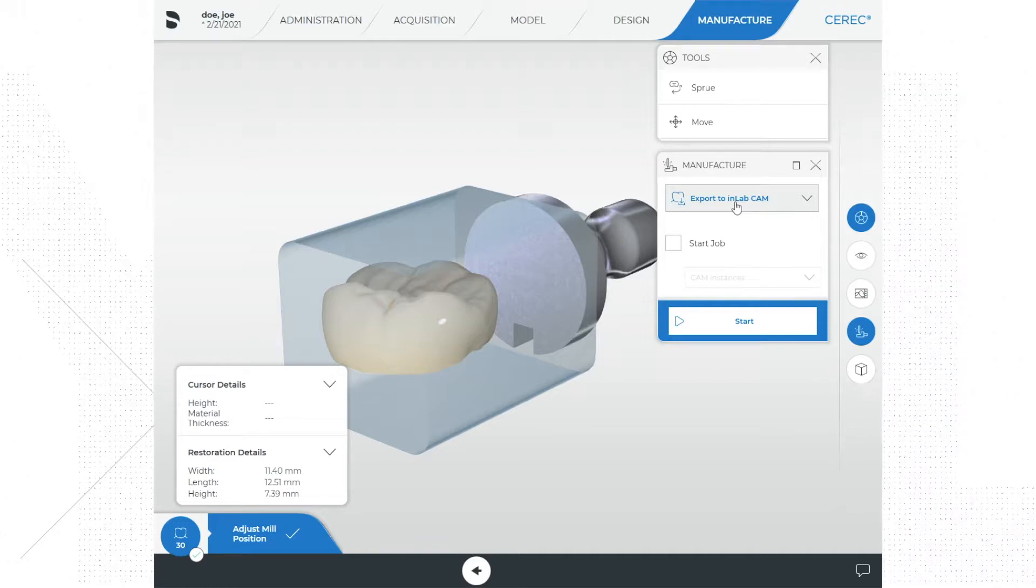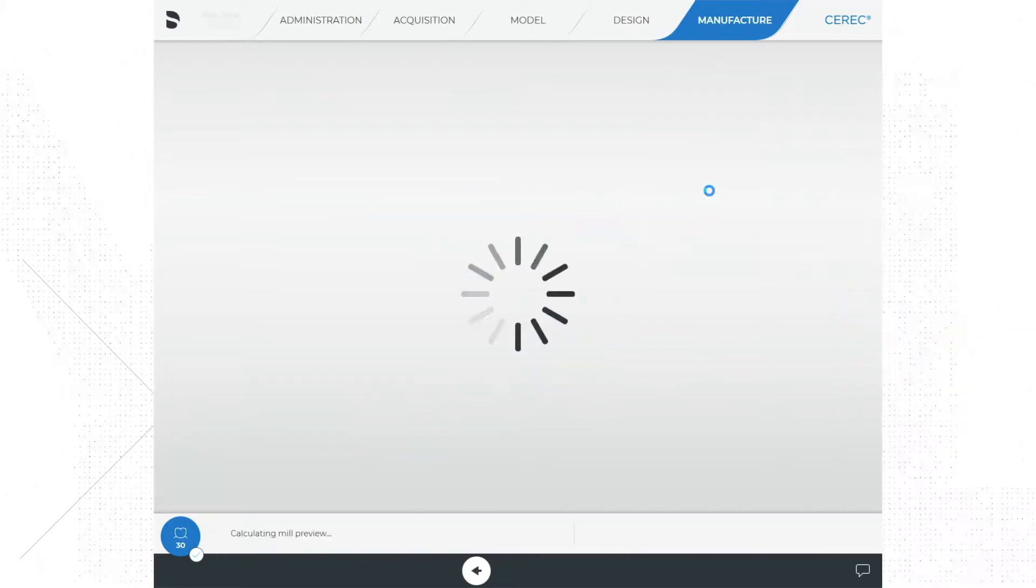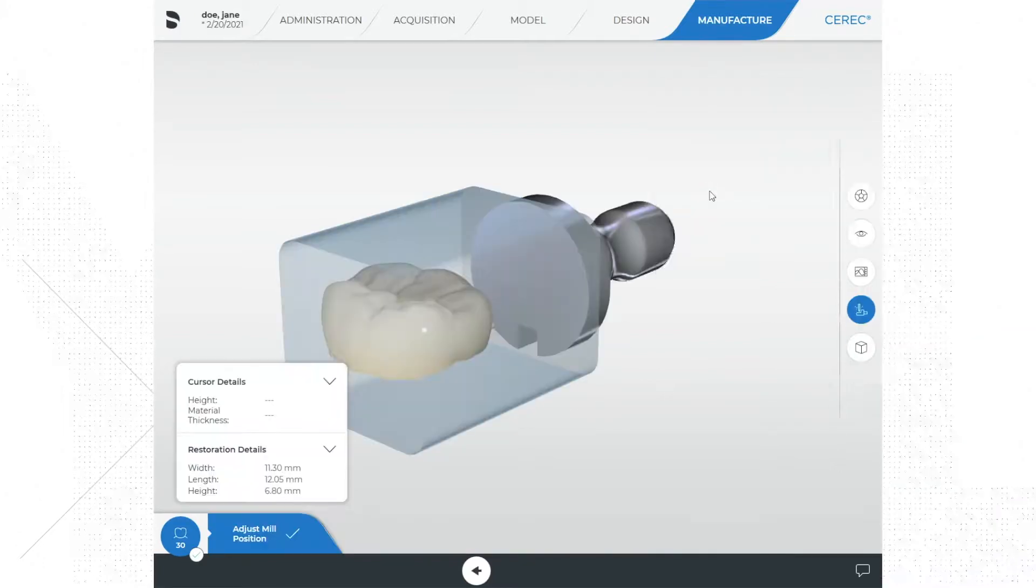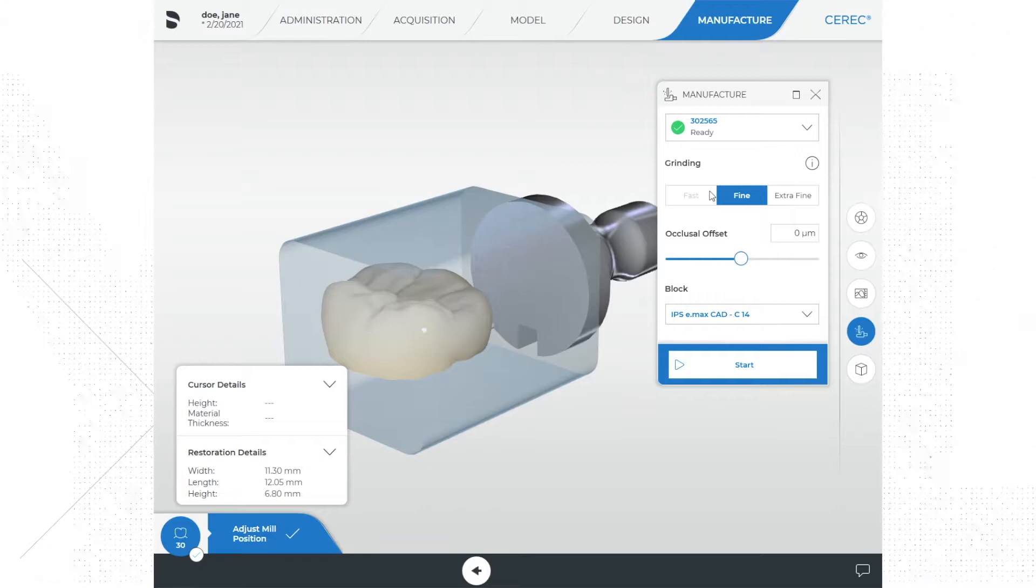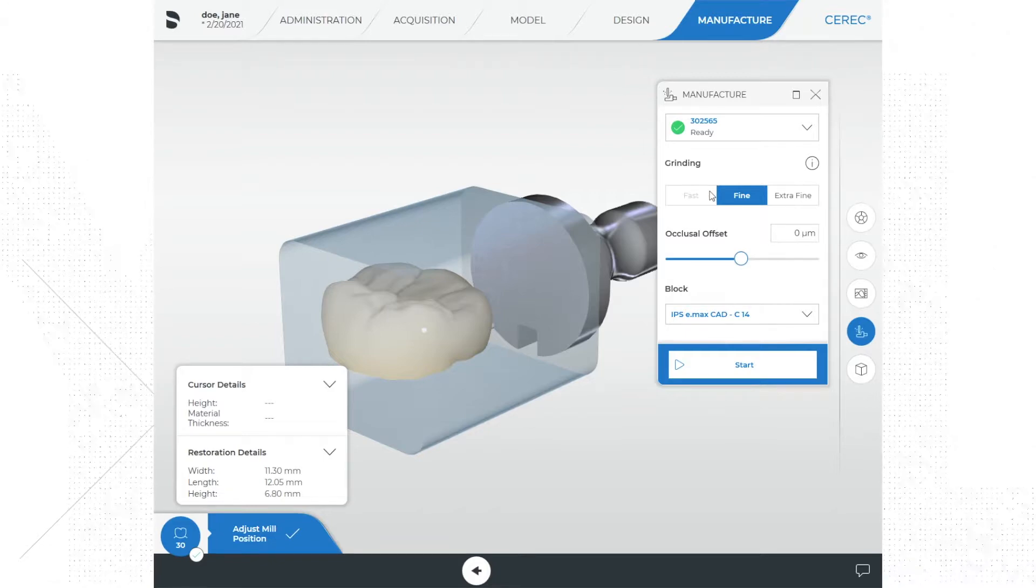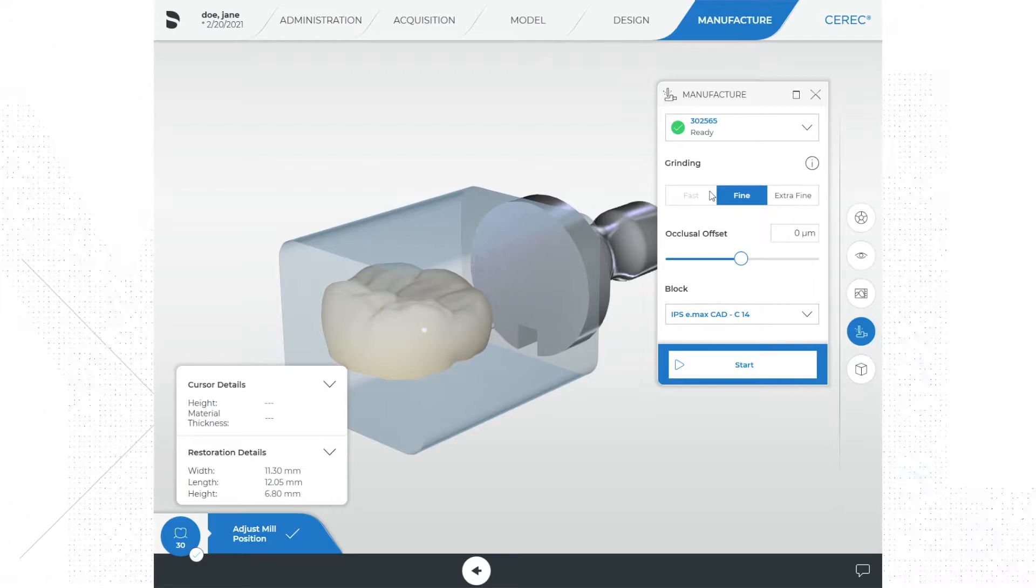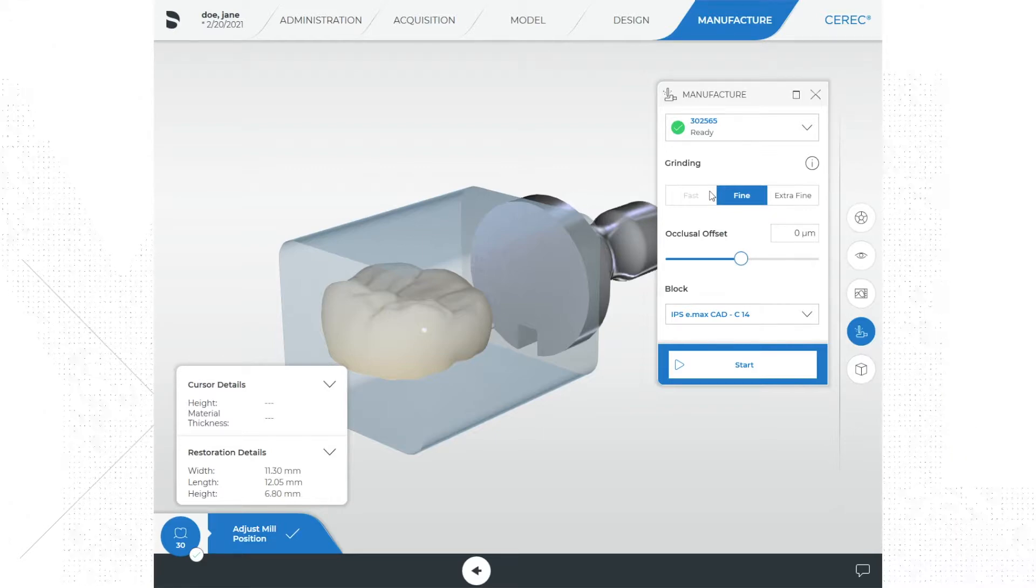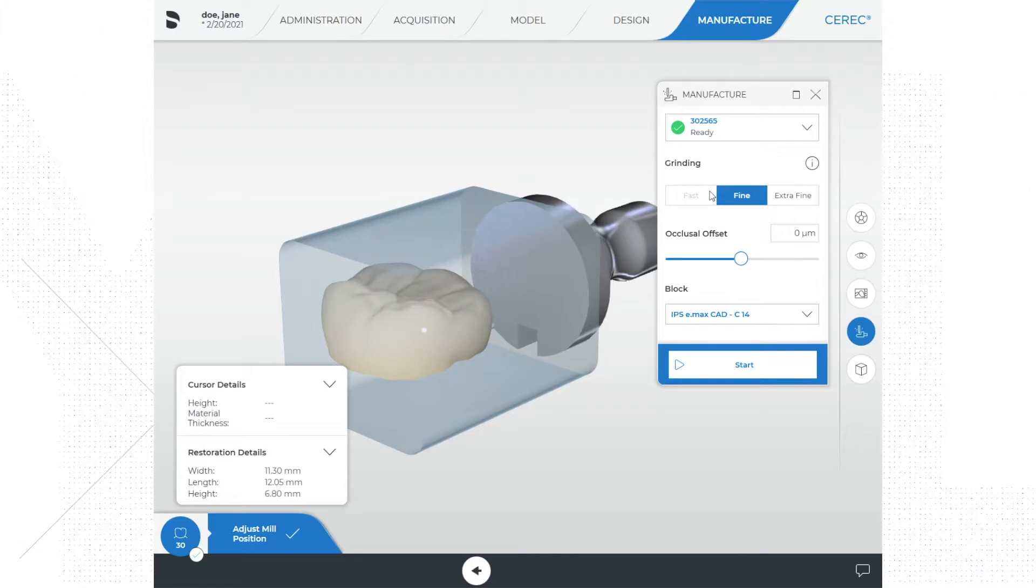Once we select our mill of choice, you will notice that we have a few options for how we will mill our grinding options. In CEREC you have grinding and milling. Grinding is completed using diamond burrs and milling is done using carbide burrs. Typically zirconia and temporary materials would be milled, and glass ceramics are fabricated by grinding.